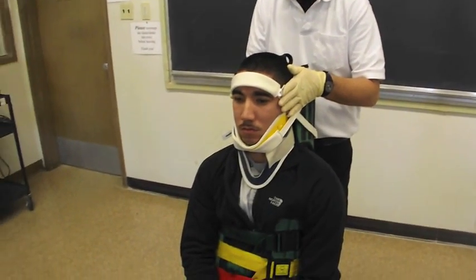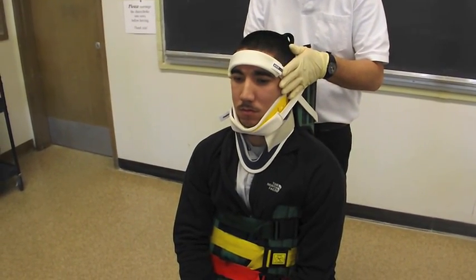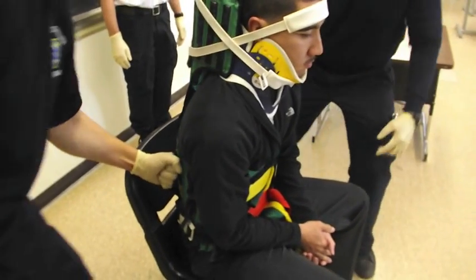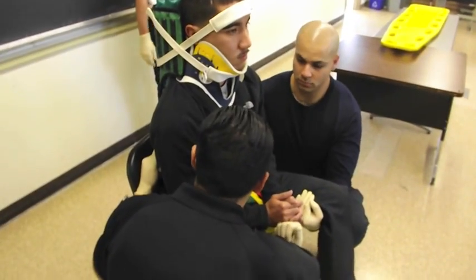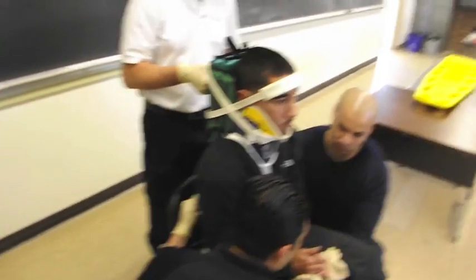Now the patient is ready to be extricated from the car onto a board using the hand strap. To move the patient from a seated position to a supine position, there are multiple handholds on the KED device — two handholds just under where the shoulder is and one handhold behind the head. Using this, Marcus and Louis will each grab the handholds along the side with one hand, and with their other hand they will go under his leg to help support the movement. Paul will grab the head strap and, because he was originally holding C-spine, he will call the shots for moving the patient.